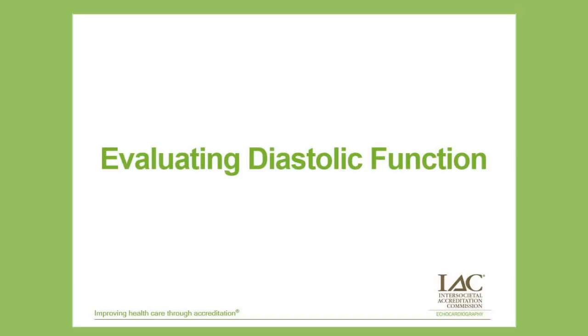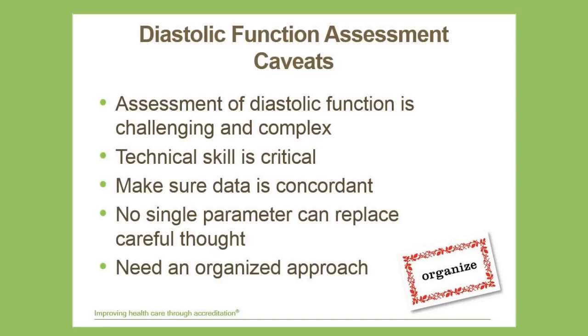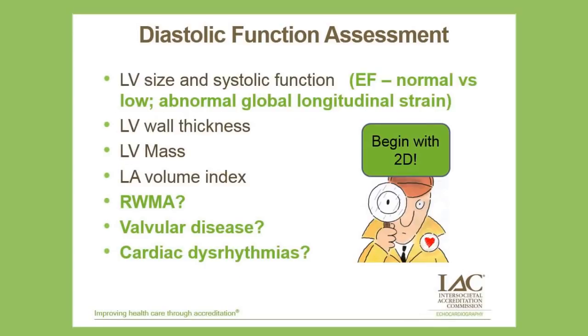So let's talk first about evaluating diastolic function. And I have to start with caveats because I will be the first to admit that I do not know everything about diastolic function. I know very few people who are very comfortable with it, and it is very challenging and complex. As a sonographer, the technical skill is critical. As a reviewer, either physician or sonographer, you need to make sure that the data is concordant, at least as much as possible. And you need to remember that no single parameter can really replace careful thought. This isn't something that you can just kind of do a couple things and voila, you have an answer. So you really need to organize your approach. And that's what I'm hoping to provide for you today.